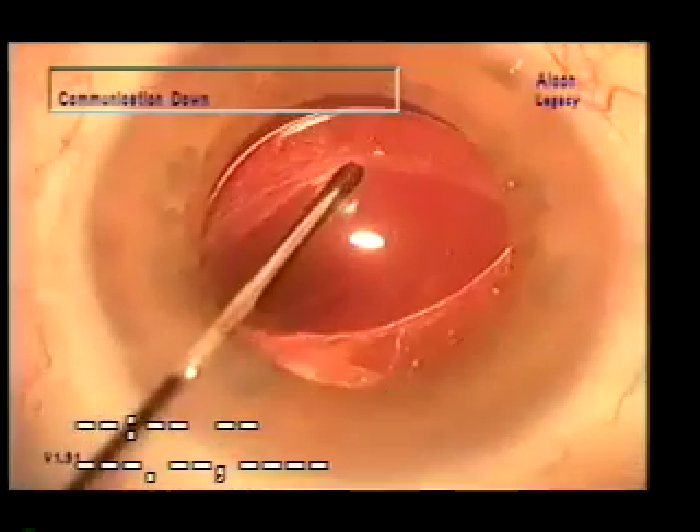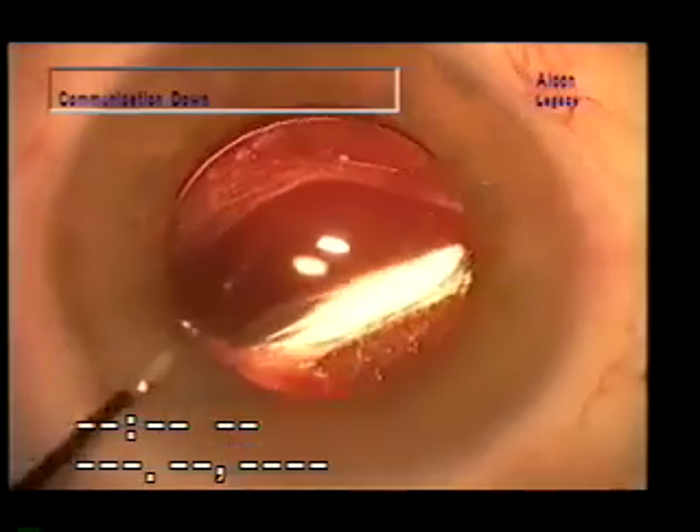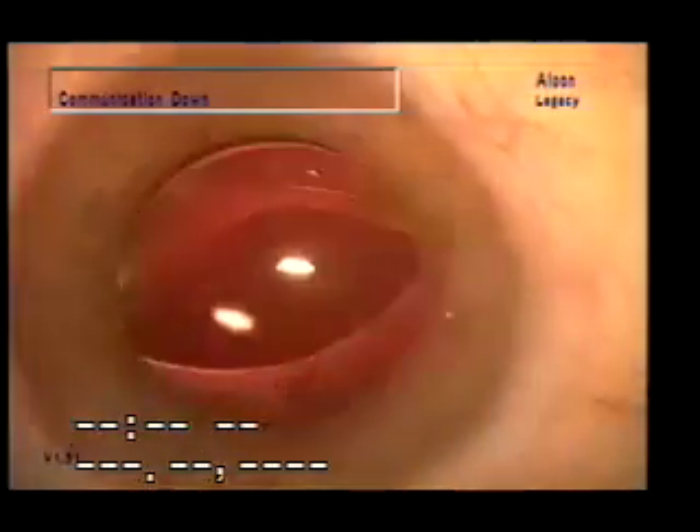Demonstrating here that the membrane is on top of the lens — the lens is now behind the membrane but the haptics are still in front of the membrane. Here's the slit lamp appearance one day postoperatively: no pseudophacodonesis.